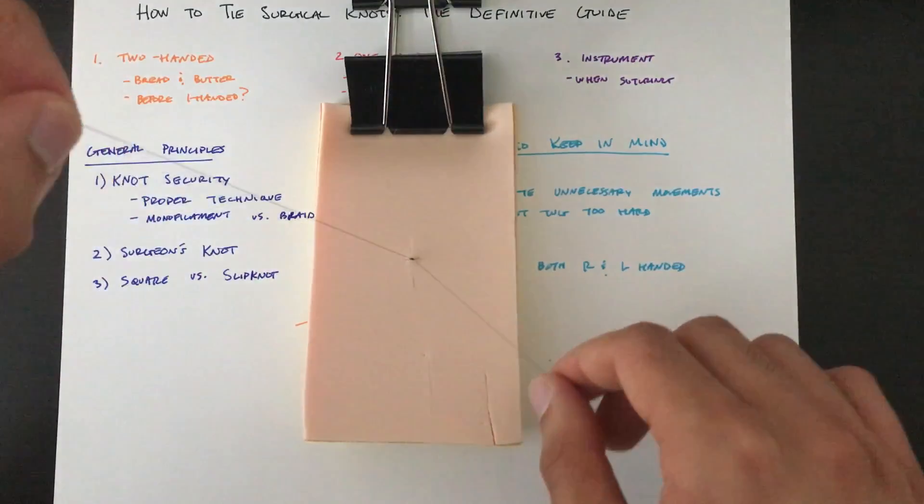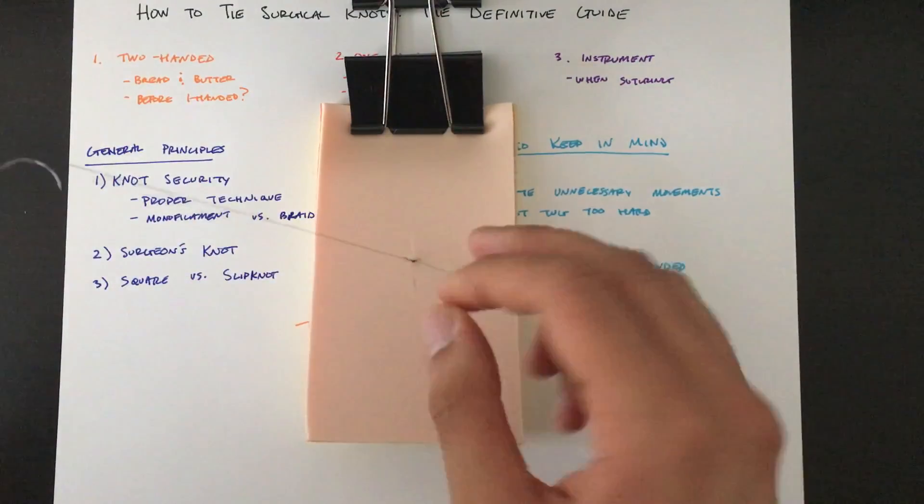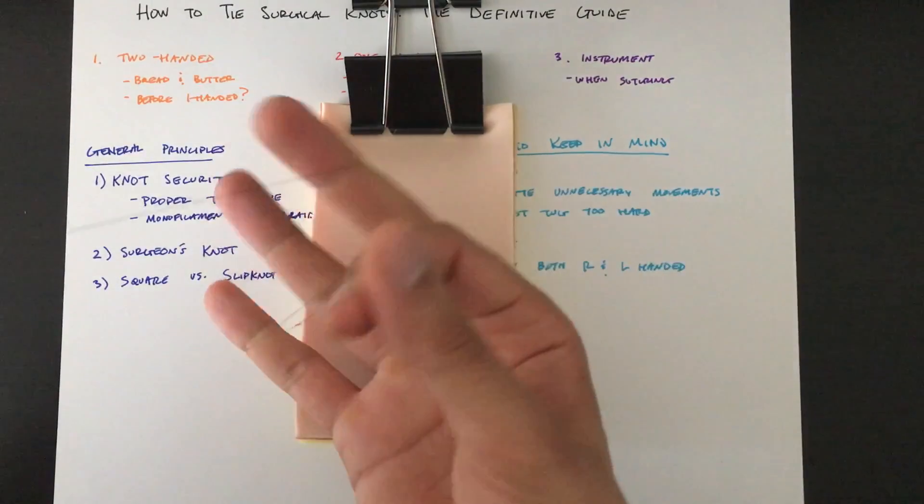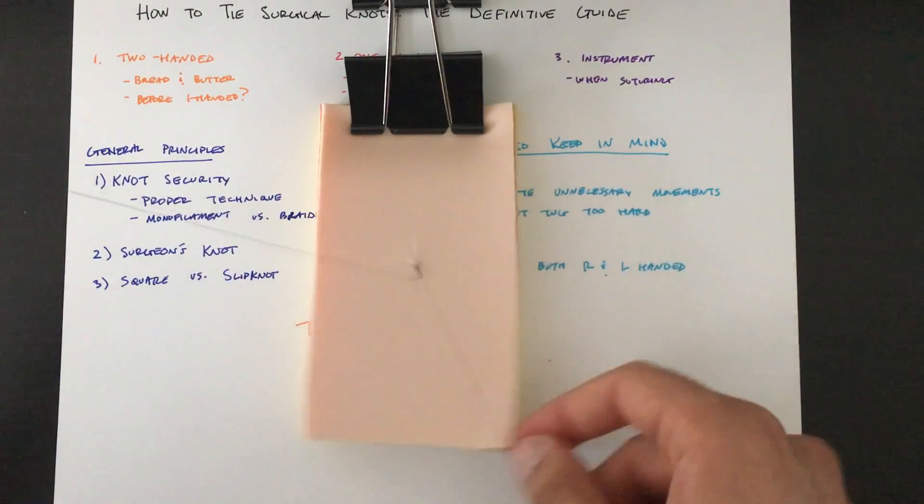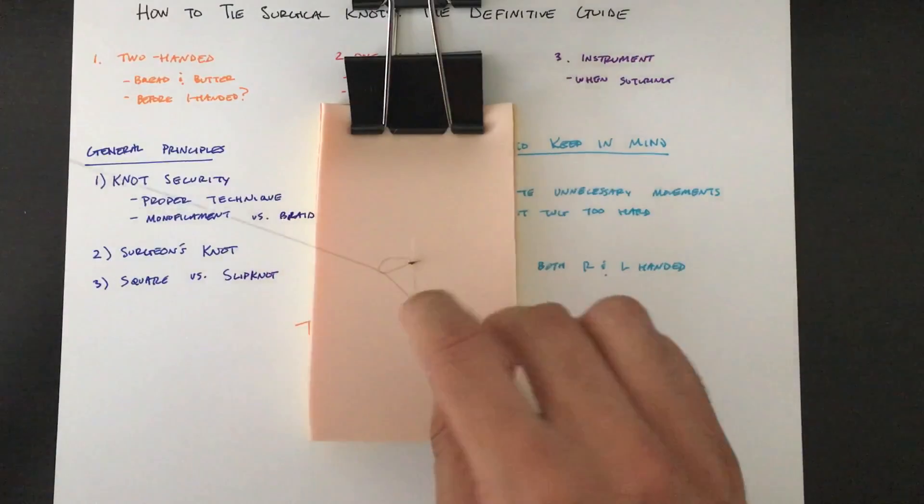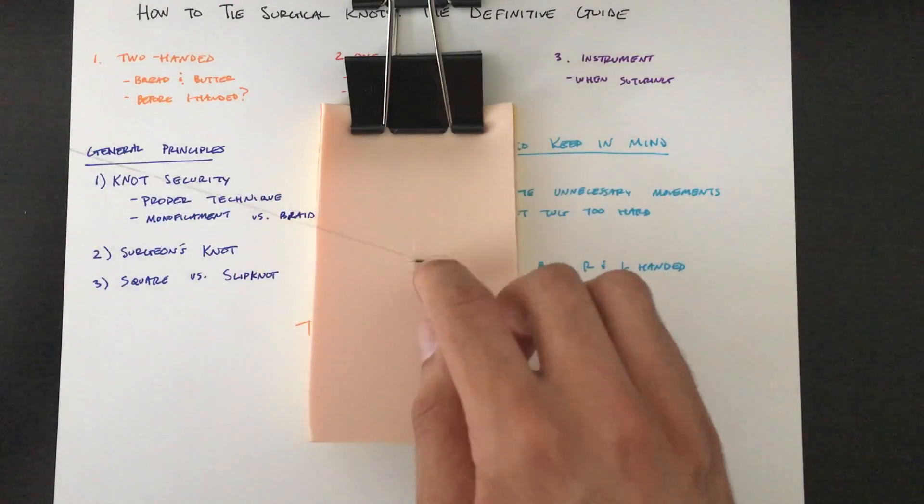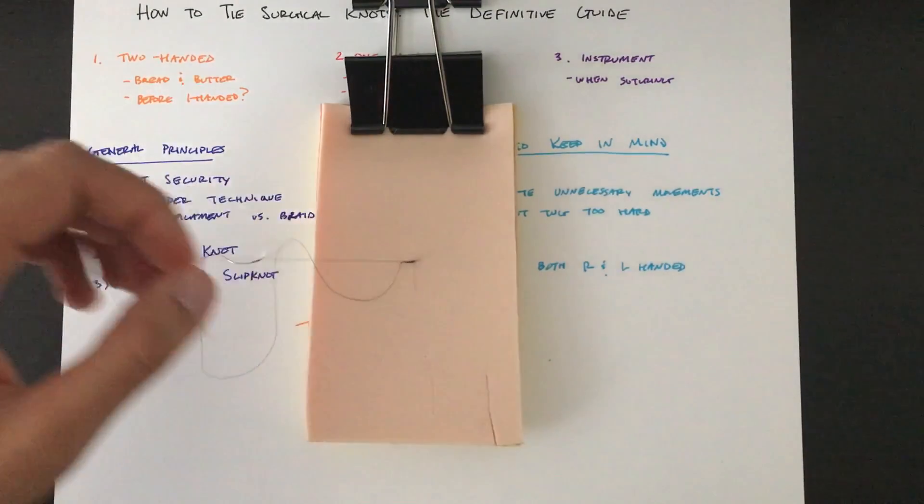As I'm going to demonstrate doing one-handed again, you want to keep your post relatively still and constant. And there you go.